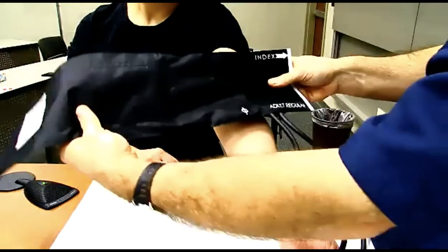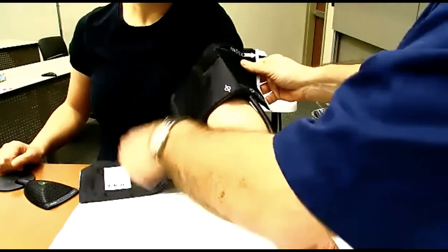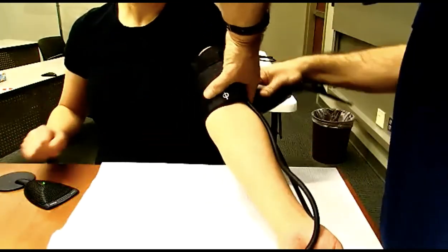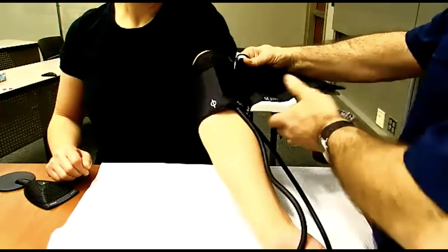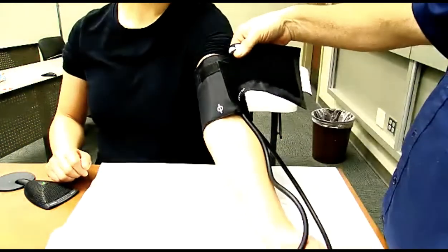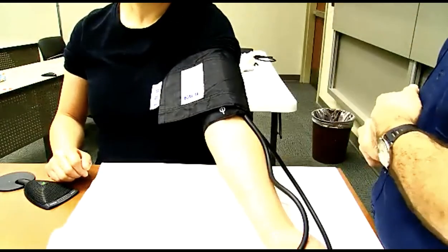So I'm going to start by putting the cuff open like this, line up the dot with the circle. Then with this hand, I'm going to hold it steady when I reach around and pull the cuff tight below there. And as I pull it tight, I want to just basically get it to touch evenly with the Velcro so that it flops over. Okay. So that's the way to do it.